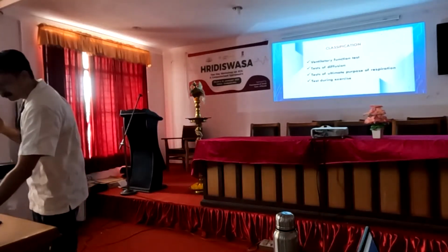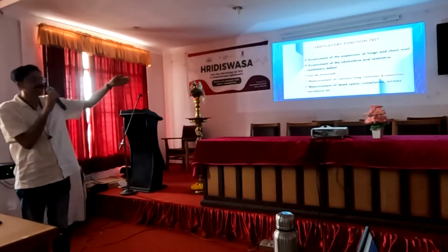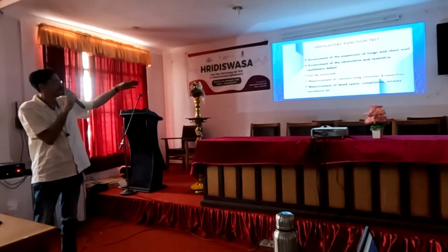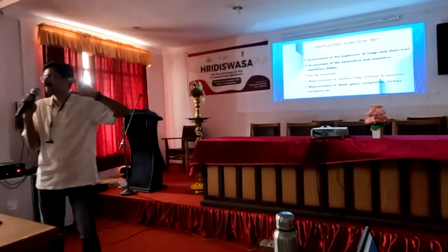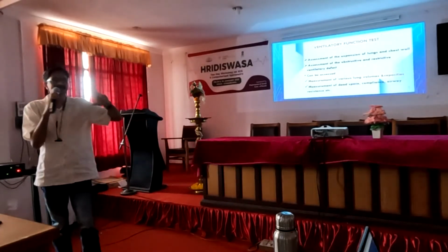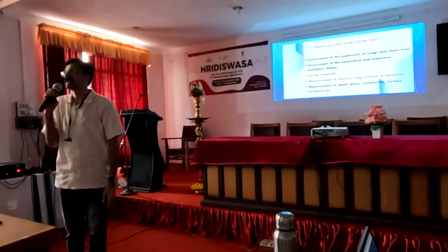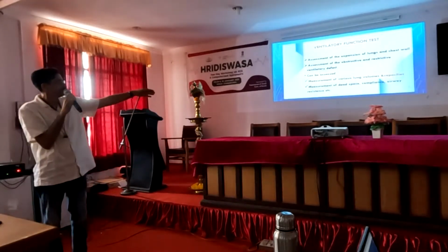Among all these tests, our topic comes under the ventilatory function test. Here we mainly concentrate on the assessment of the expansion of the lungs and the chest wall, and the assessment of obstructive and restrictive ventilatory defects.